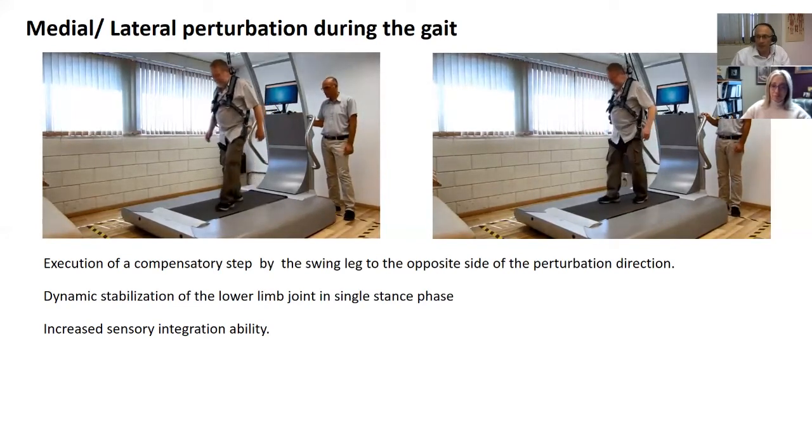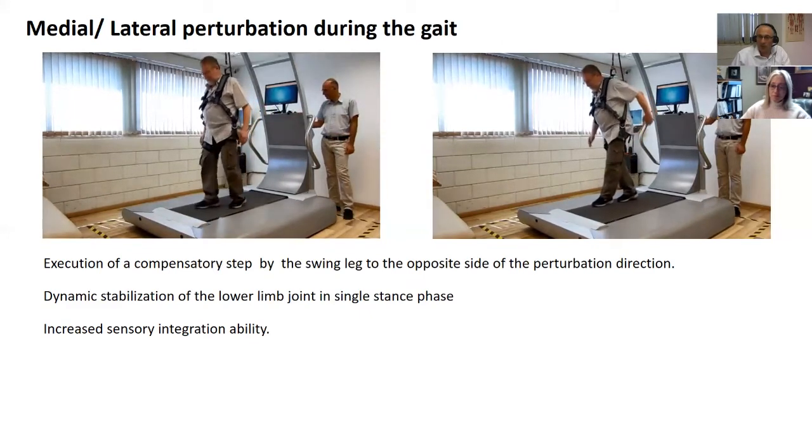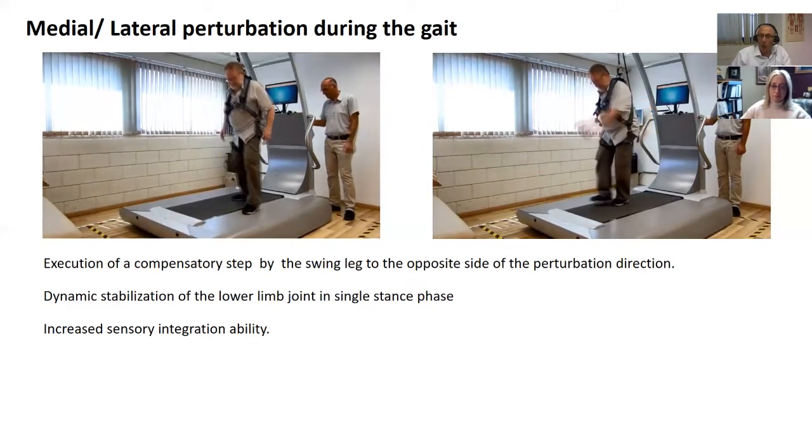Do you think there's anything going on here about when you're doing a crossover step, you're actually shifting your body weight over your own midline?